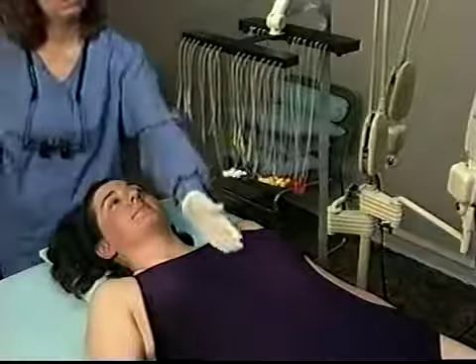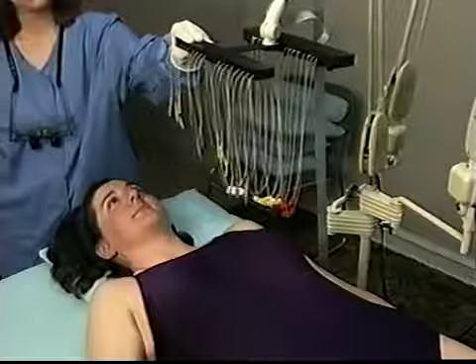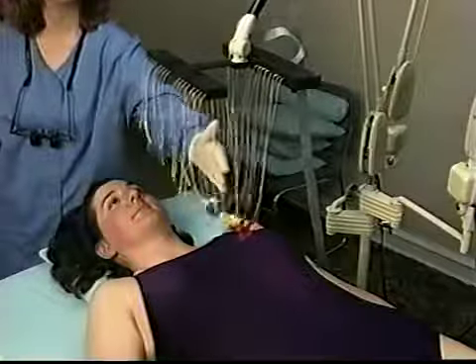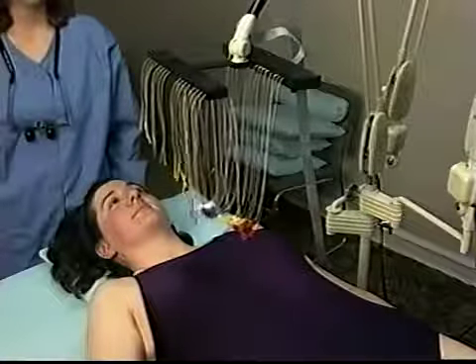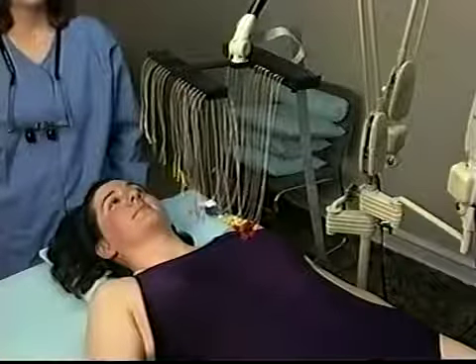For the sternum, position the rack in line with the treatment area. With a slight adjustment, this will also accommodate the right breast. For the left breast, I generally turn the patient around so her head is in the opposite direction. It is unprofessional to lean on or too far over the patient to try to reach the far breast.